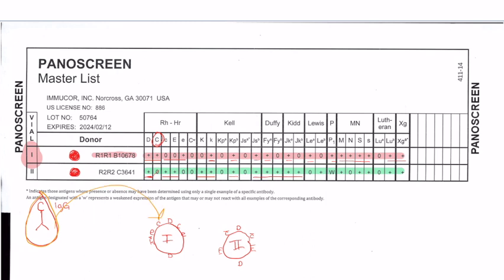We're going to mix it with this cell and mix it with this cell. So that antibody to big C will bind right here because it's a big C. All right. This one, on the contrary, number 2, there's no big C on the outside of this cell. So this big C antibody doesn't have anything to attach to. Okay, so let's think about that as we proceed with this test.